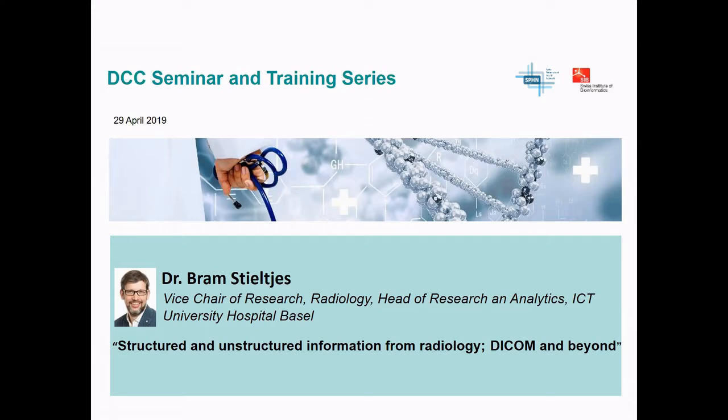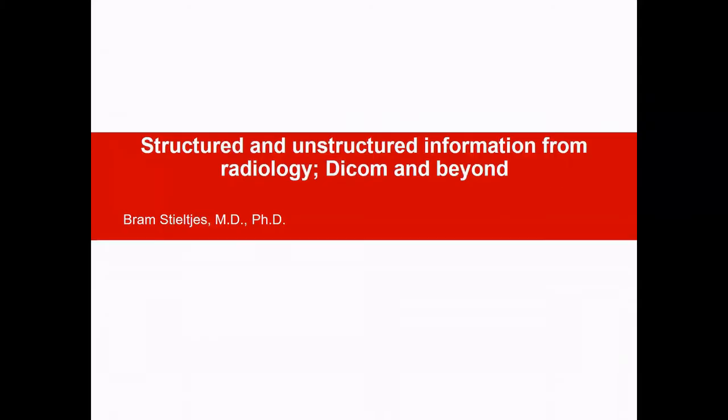I got the request to talk about DICOM in the beginning, and so I will do that, but as Sylvia introduced already, I'll also talk a little bit more about what else is there in radiology. Because DICOM is basically an industry standard for communication and formatting of images and other medical information that was set up, I think the first draft of it was in '82 or '85.